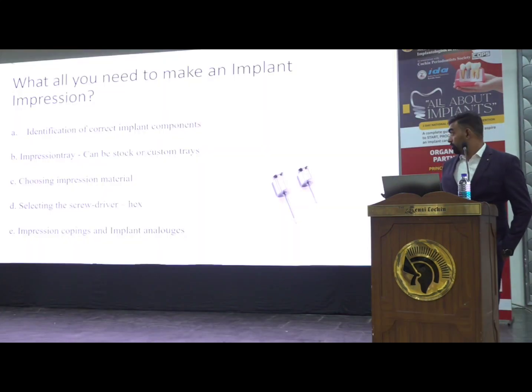Screwdriver: hex, short hex and long hex. For the posterior region, you can use a short hex, and for the anterior region, you can use a long hex. And the final and most important things are impression copings and lab analogs.